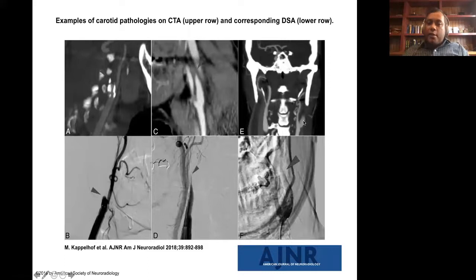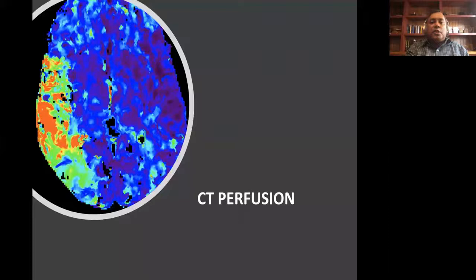Although, on the CT angiogram, it may sometimes be difficult to accurately predict whether this is a complete occlusion or a false occlusion, but there are some clues. And one of the clues is this sort of ghosting appearance in that area. So those are things you can actually look for on the CT angiogram and plan your intervention accordingly.